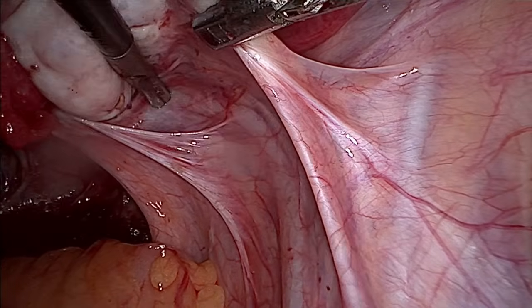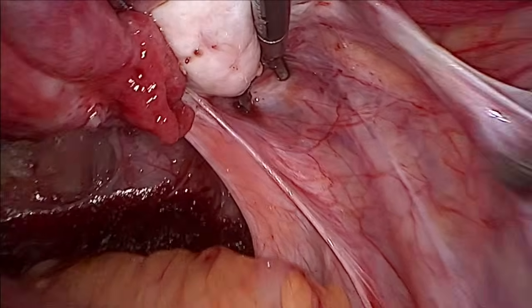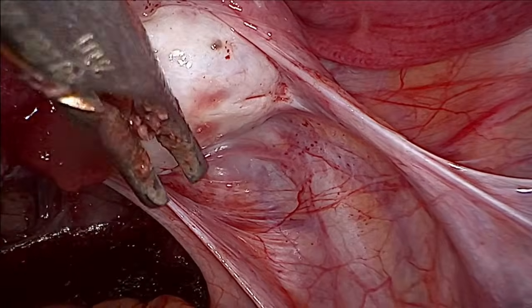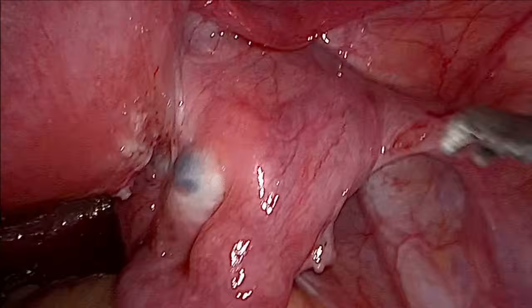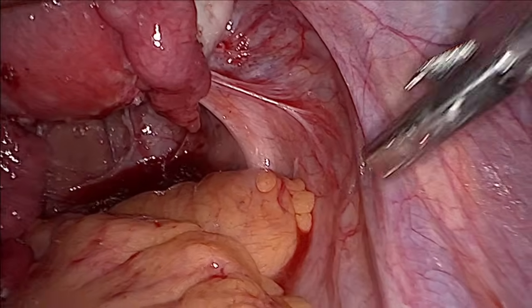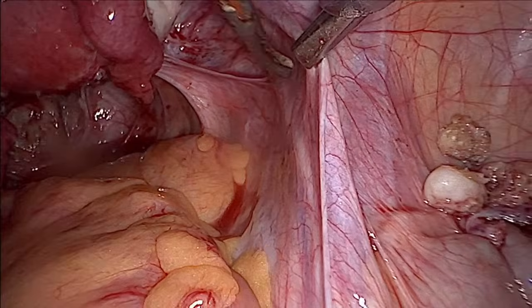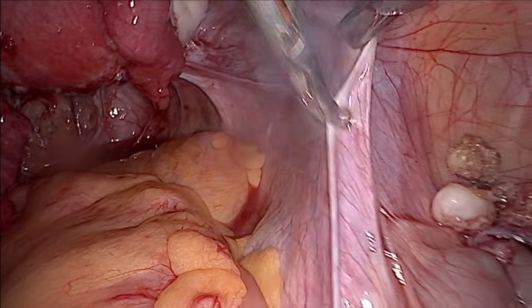Okay, but then here there is medialization of the ureter here. Okay, so we need to do a ureterolysis and first clear the ureter. Just hold this, there is no need to, you come with the camera behind. Okay, so you can see the ureter here. Okay, you can just go here and just put a small nick here.